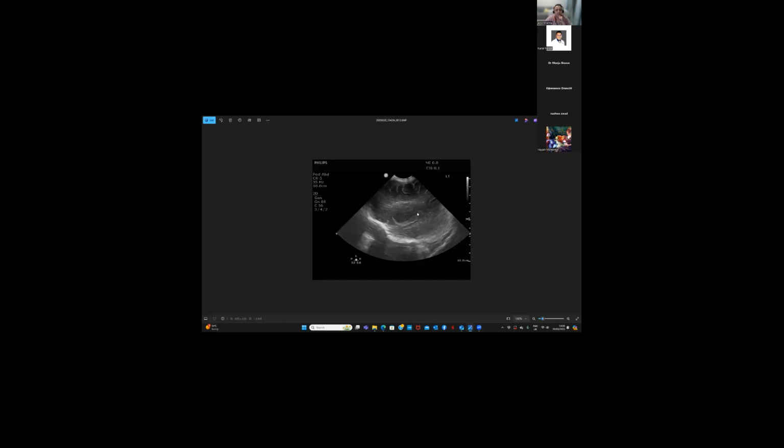Then yeah, this is the most sagittal for the left side. Well done. I was trying to take some pictures, and I have gone to the mastoid as well. But look, I don't know if they make any sense. It will come. This one was the left mastoid. It's a good try. You have a very small mastoid fontanelle in term babies. It's very difficult unless you've got hydrocephalus and it's open.